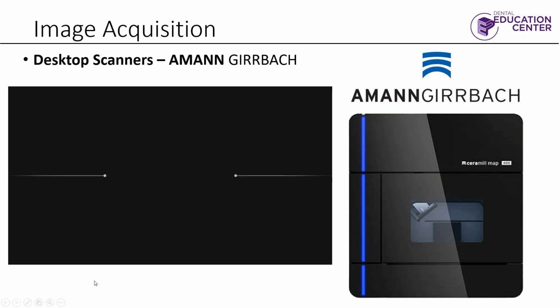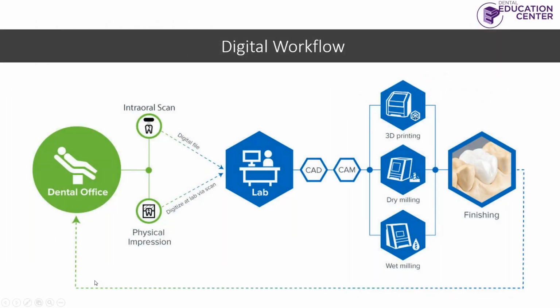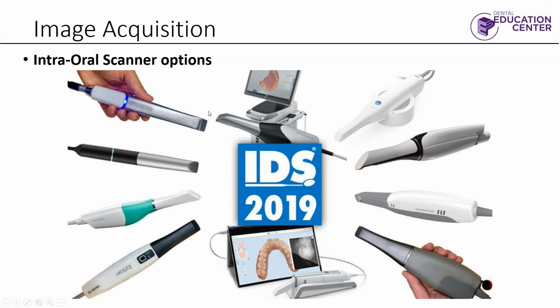All right, so we're moving on. Right now we're kind of in this area, going through image acquisition. What I thought now is we jump into intraoral. This was just IDS this year or last year. Intraoral scanners were everywhere, at least it seemed like it. Everyone and their brother had one.